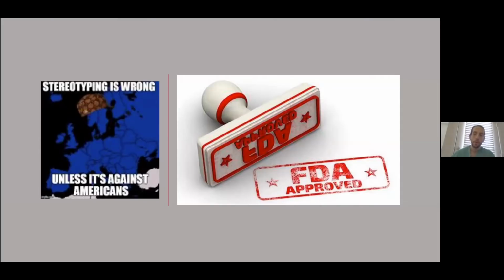So it's important to recognize that there's only 3 FDA-approved ultrasound contrast agents. Those other 2 are not yet approved in the United States, and none are approved for trauma per se. And the other 2, the Optison and the Definity, are actually echo agents, and I don't think anybody that I'm aware of is trying to even use those for trauma.